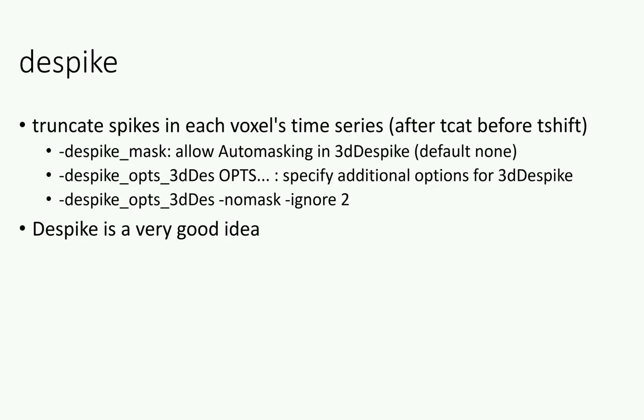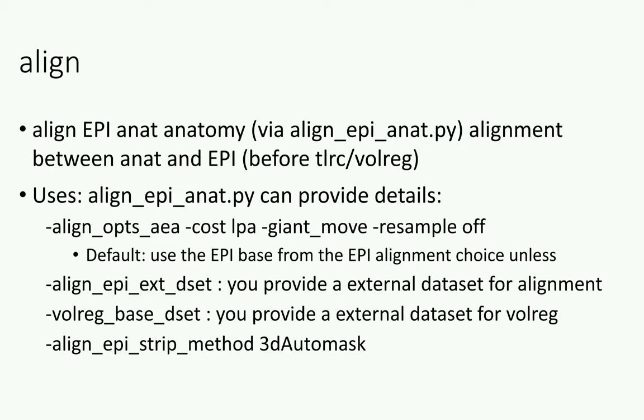So how does despike work? Despike, when we looked at mean outliers before and the outlier file, works a lot within that regard. It looks at the absolute value of the deviation, and it marks things that are outside that and interpolates the data that is marked as an outlier. So despike is excellent for bad data, and it will not harm good data.